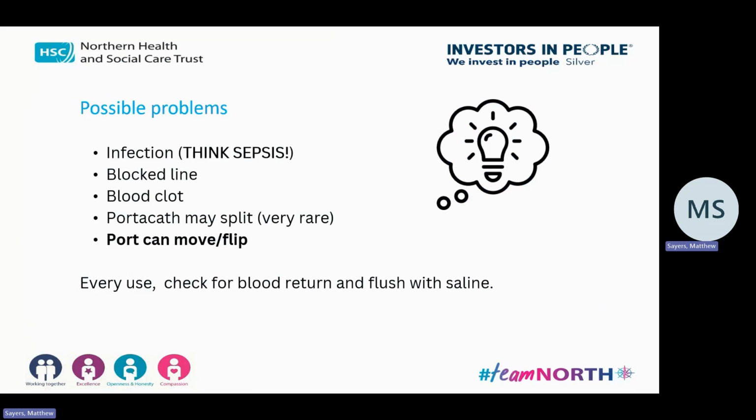We would also have been told that the port flipping or moving is quite rare, but our one has fallen off, so yeah, it's possible. But we have been in a situation in the last 12 months where we've heard about 4 or 5 that are flipped when they've been accessed. So instead of hitting the septum, you're just hitting the back of it.